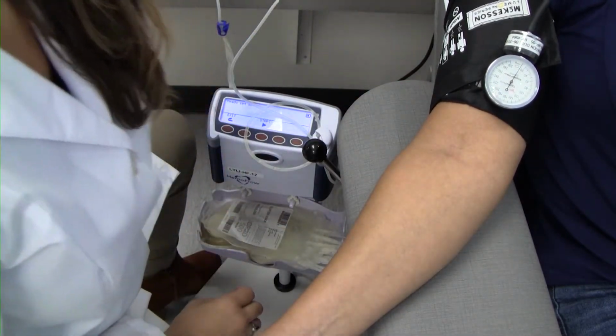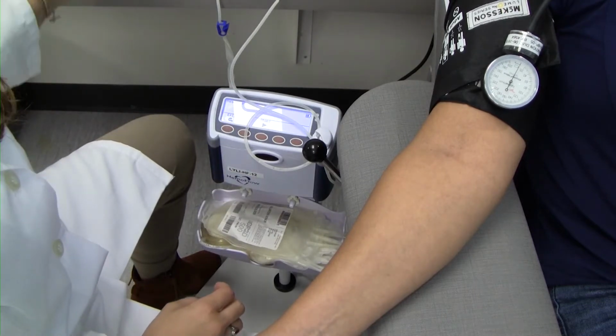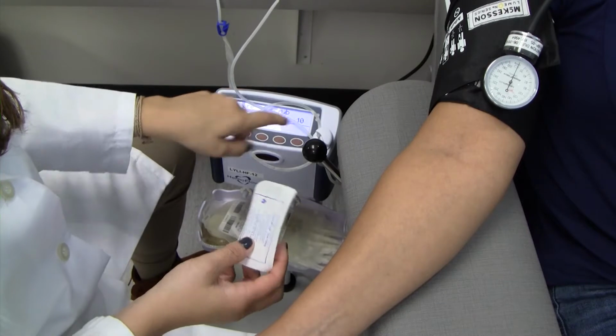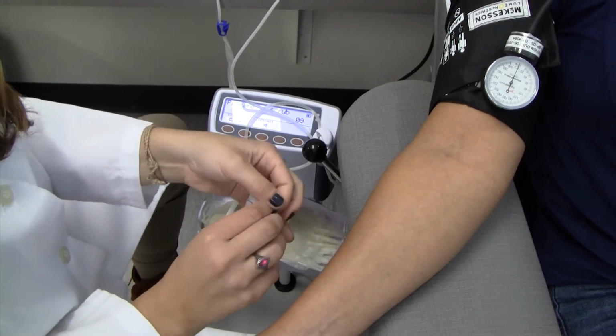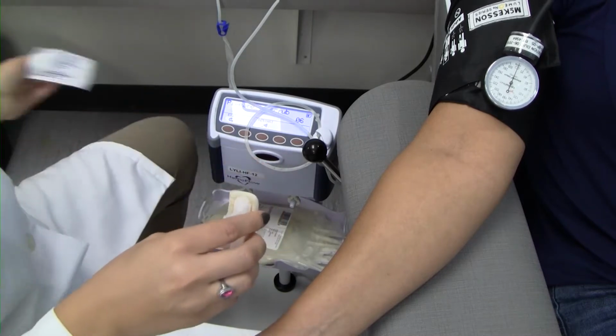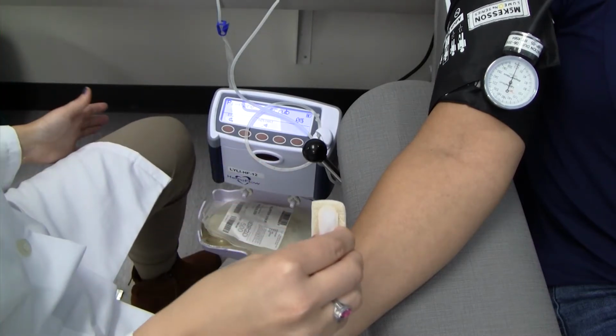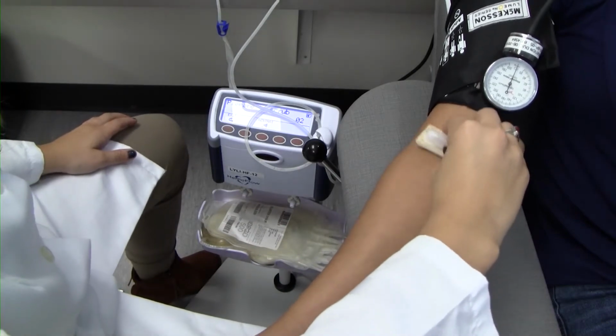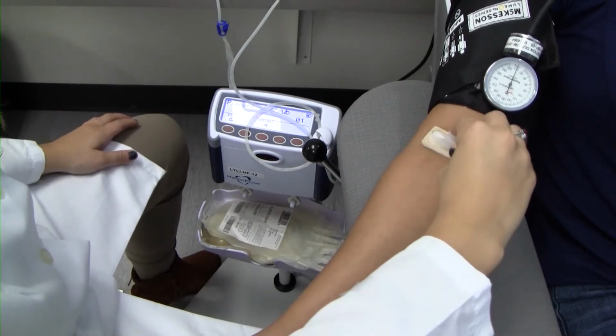On the hemoflow, press start to begin the arm scrub and dry timers. During the arm scrub prep timer, remove the ChloraPrep applicator from the package. Pinch the wings once to break the ampule and release the antiseptic. Press and release the sponge repeatedly against the selected area until liquid is visible on the skin.